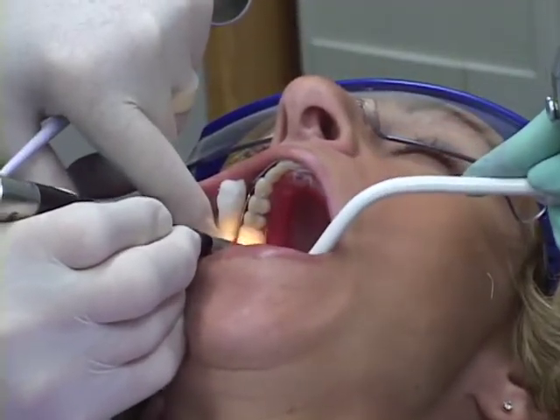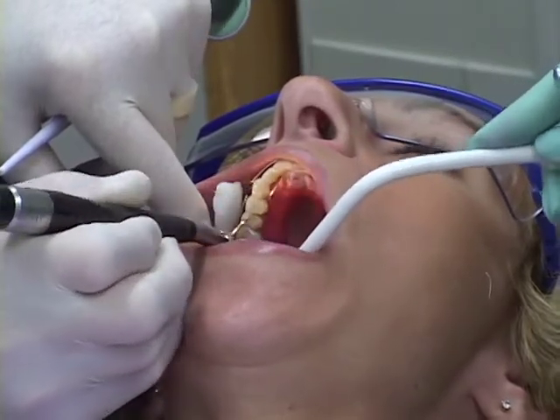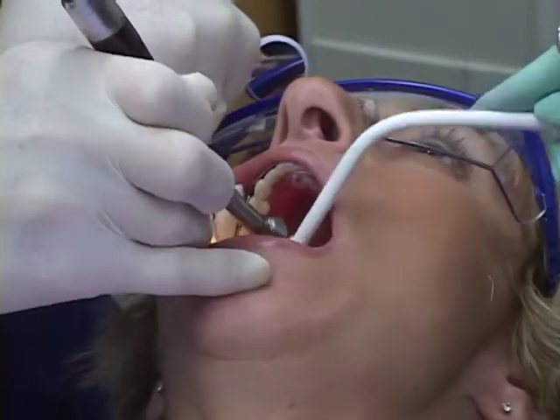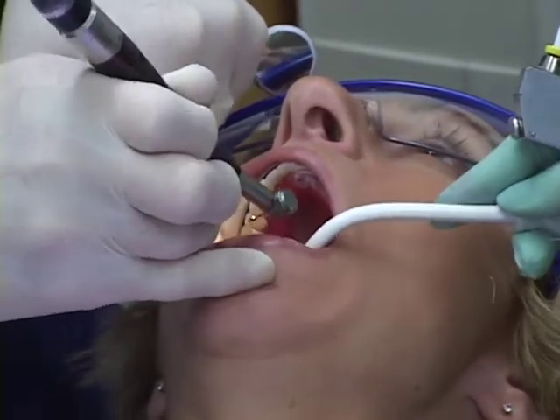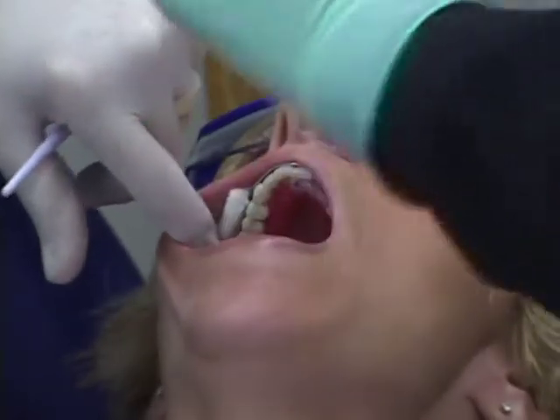Again, when I'm recontouring, always keeping in mind trying to reshape the tooth in such a way as to end up with the cusp tips and the fossae and the marginal ridges, the only points of contact. That's good.